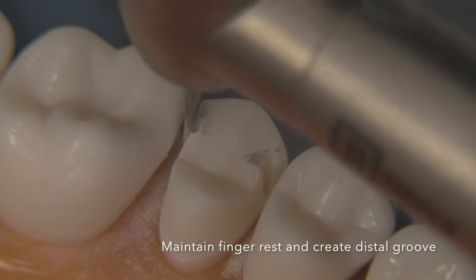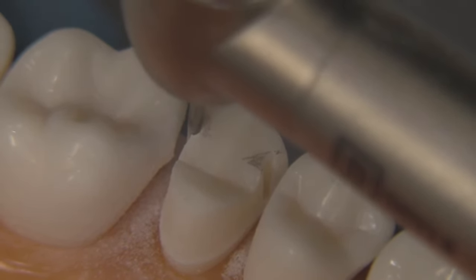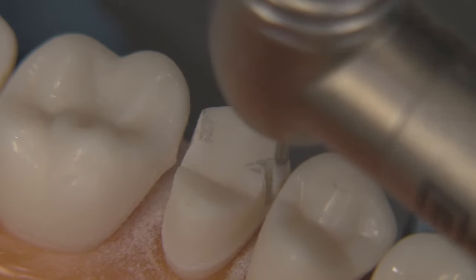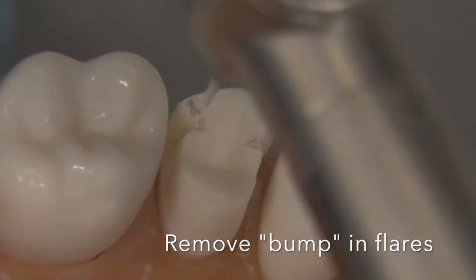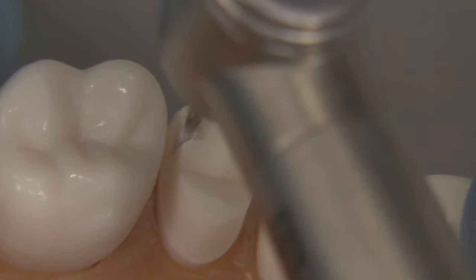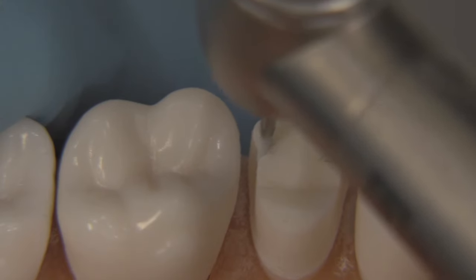To line up the groove on the distal, pick up the bur, move it over from the mesial to the distal maintaining your finger rest at all times, and you'll have a much easier time getting the grooves to line up properly. It's not easy but it gets easier with practice — we recommend trying this on the bench top before moving to a mannequin system. The grooves are positioned; we may have little bumps in the flares between the groove and the previous flare, and I like to smooth those off so they come out at a straight angle.